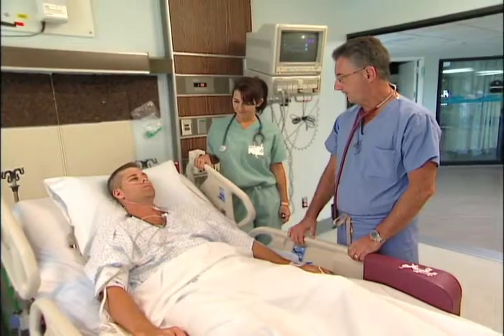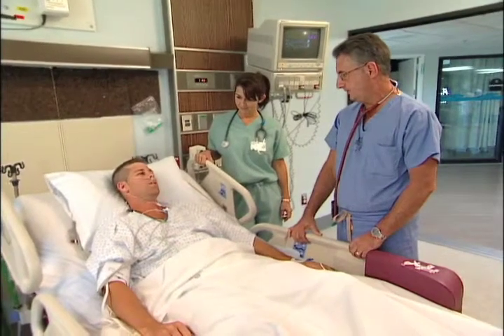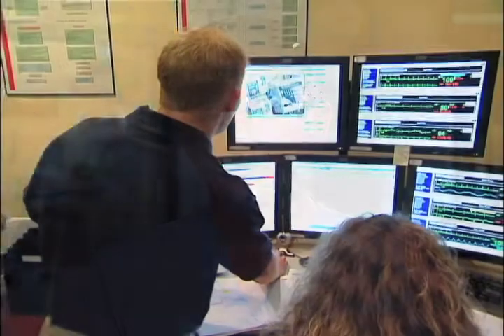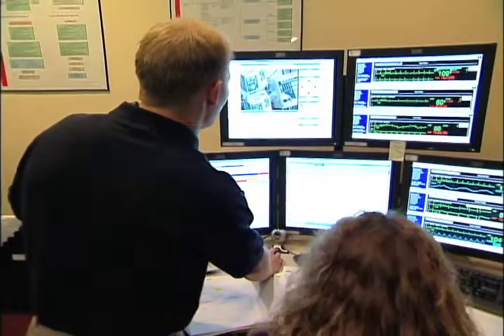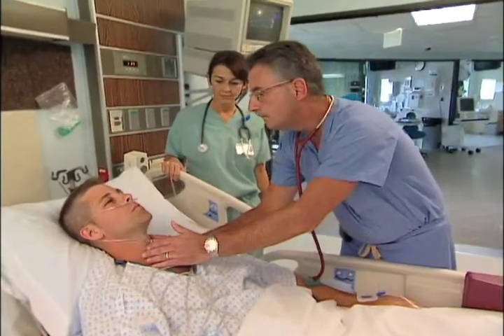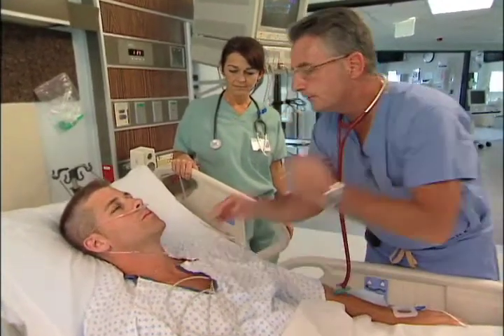Heard your heart went a little bit crazy last night, huh? Yeah. Did you feel that? The other night, one of my patients who was very unstable to begin with, who had had a heart attack, went into a very rapid tachycardia, or fast heartbeat from the top of their heart. The EICU recognized this immediately, as well as the fact that there was only one thing that could be done in that situation, and that was sedate the patient and shock them back into their regular rhythm.